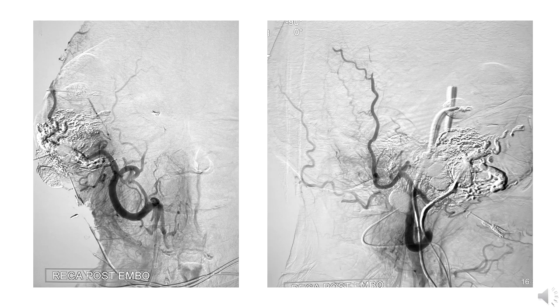ECA injection after embolization completion, we can see that most of the tumor is now gone. The blush is the normal blush of the masseter and the parotid and the occipital region. We can see that there is some pruning of the STA branches, which was unintended, but it has happened. But usually there is no consequence in this because the distal territory is being perfused via collateral. So we can see there is practically no filling of the tumor now after the embolization.